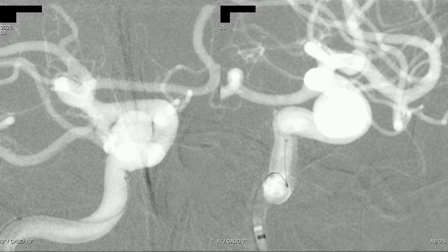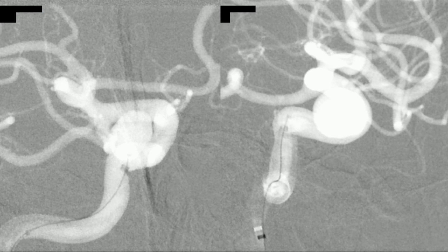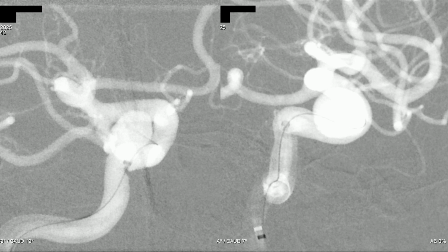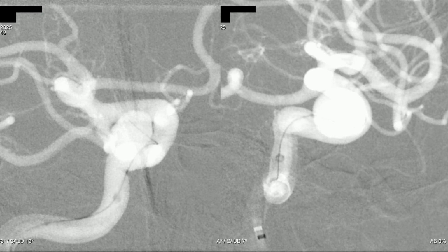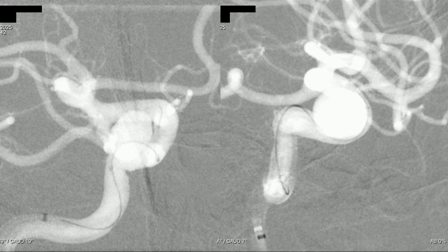We push the intermediate catheter a little bit distally to have a good basis, and now we push the microwire all along into the aneurysm sac and try to push the microcatheter inside the aneurysm sac, but as you can see, it's a very hard curve. That's why we couldn't do it.